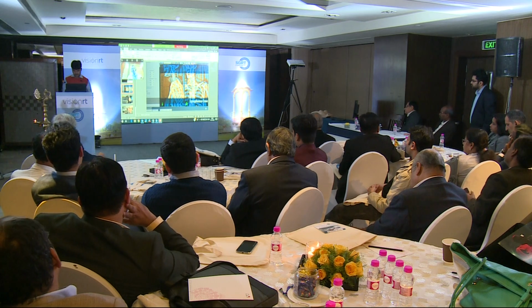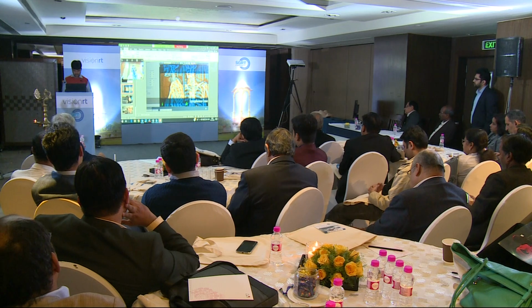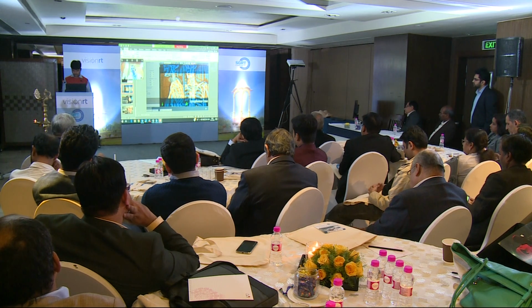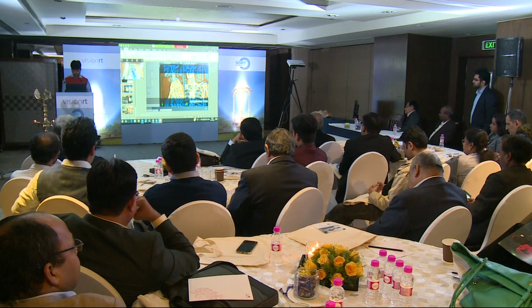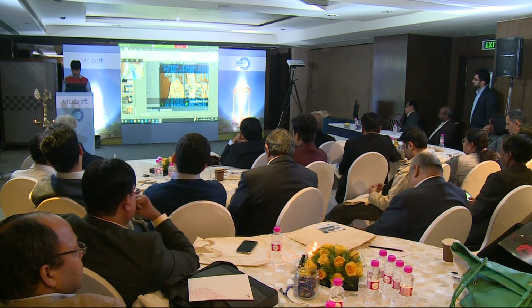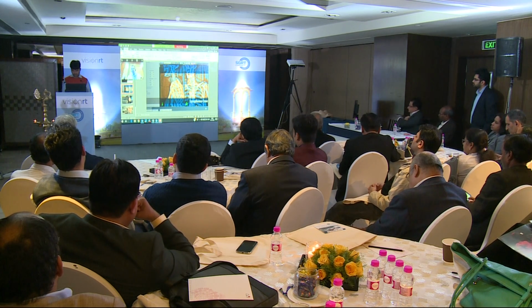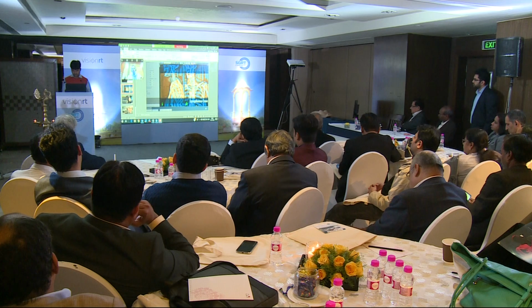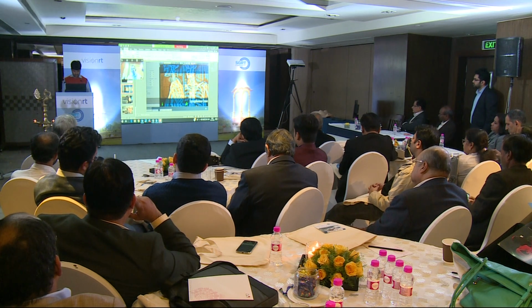So it's a very good tool for not only setting up your patients and monitoring your patients, but it's also a complement to what your already existing IGRT technologies provide, but where they kind of fall flat. IGRT, again, moves things in a rigid fashion. It doesn't account for these pliable posture-based setups that really are patient-specific, especially patients who are in pain, and a lot of our patients have bone mets and those types of things.